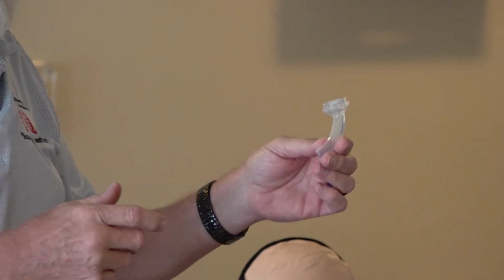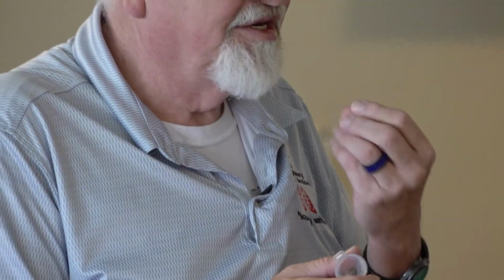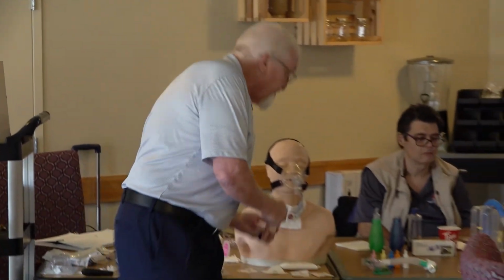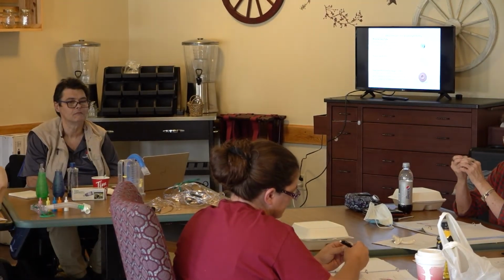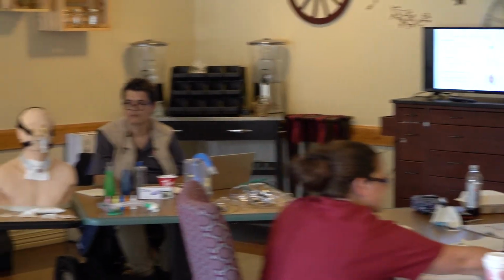So when I go in to do trach care, Lary care for Bob, all I'm doing is taking this out, cleaning around the stoma if it needs cleaned, and putting it back in. We're done. These things here, feel those, check them out, and pass it around. These are HMEs, heat moisture exchange.